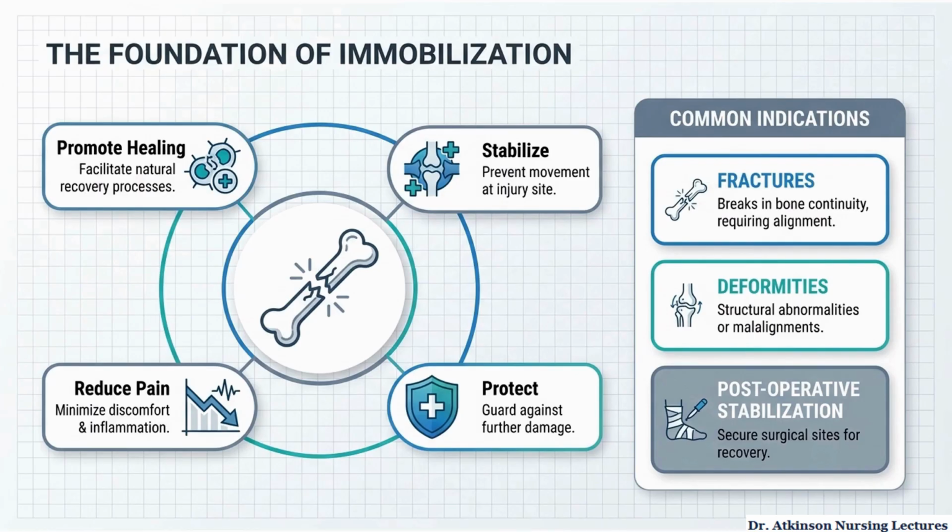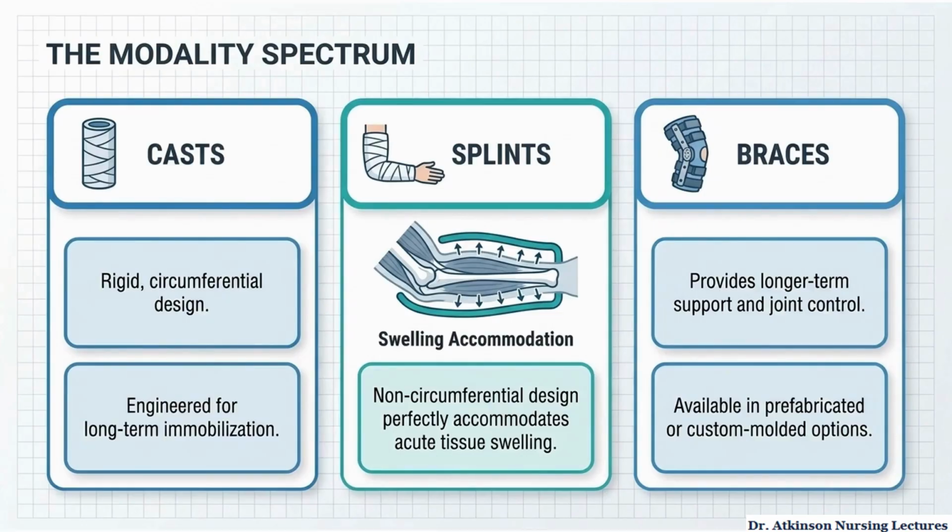Device selection depends on the injury type and clinical goal, whether that is temporary ED stabilization or long-term post-surgical support. Nursing monitoring must match the severity of the injury because higher-risk patients require closer neurovascular and complication surveillance. Casts, splints, and braces each serve different immobilization purposes.